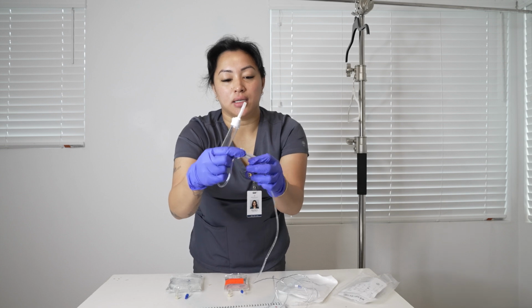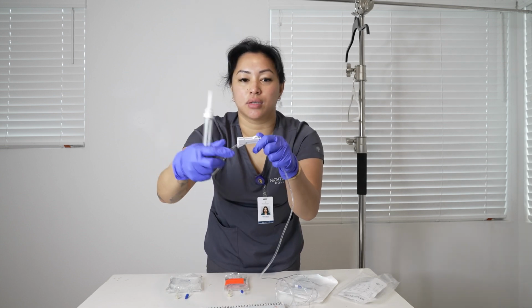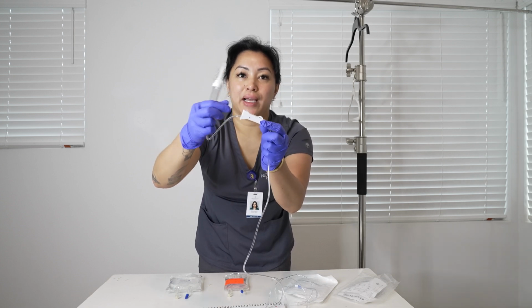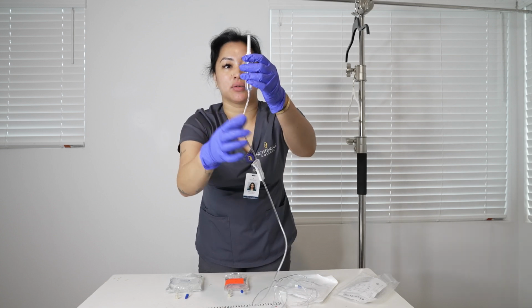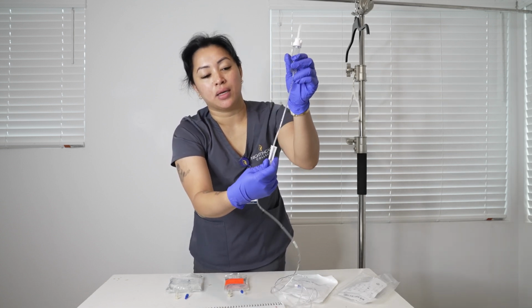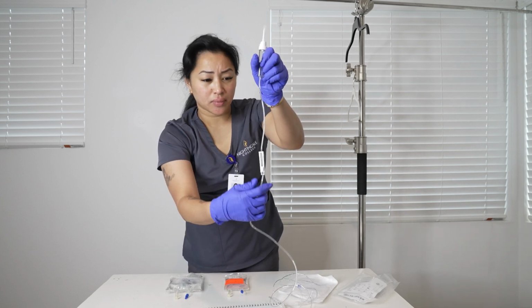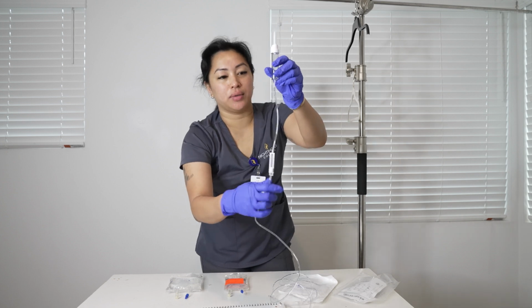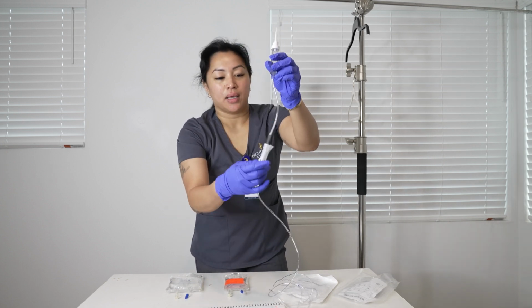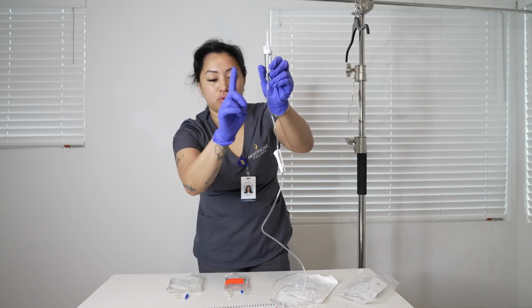So then right here is the roller clamp, and so the spike, the drip chamber, and then the roller clamp. You always have to make sure that the roller clamp is rolled down before you prime any tubing to prevent it from leaking out all the way. And this is where you can regulate the rate of the drops.